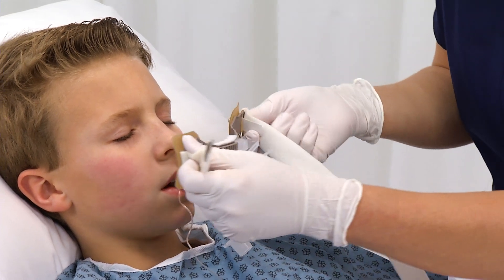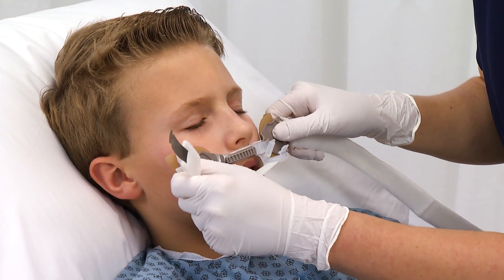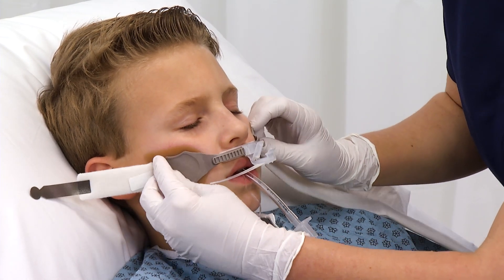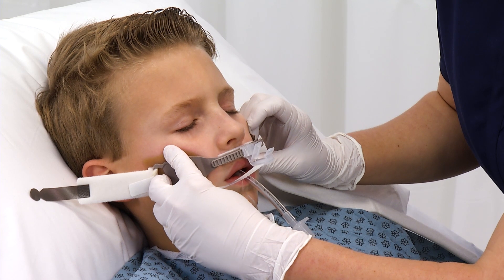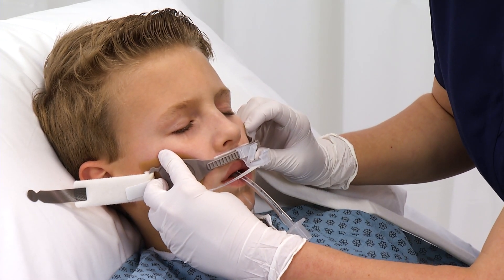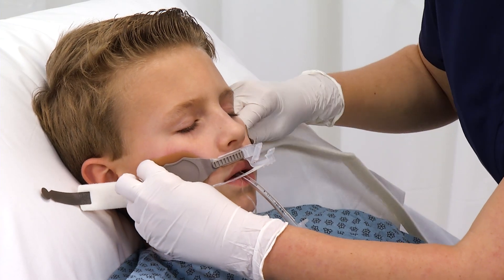Center the device on the patient's upper lip so the upper lip foam lightly touches the skin. Press the two skin barrier pads on the patient's skin and hold in place until they adhere well. This should take approximately 30 seconds.